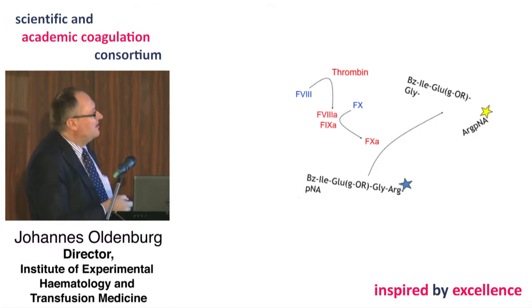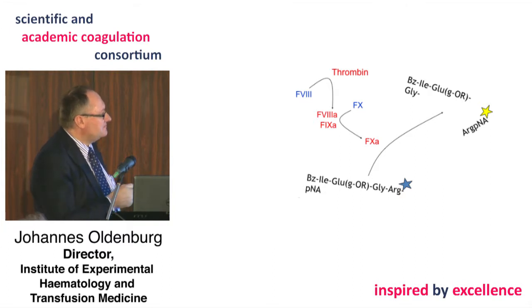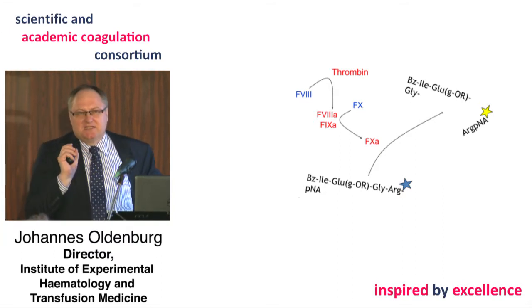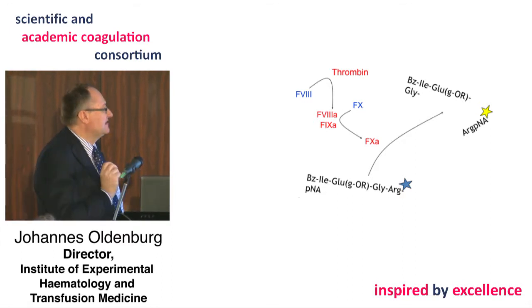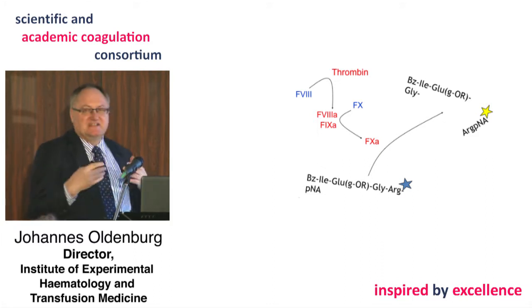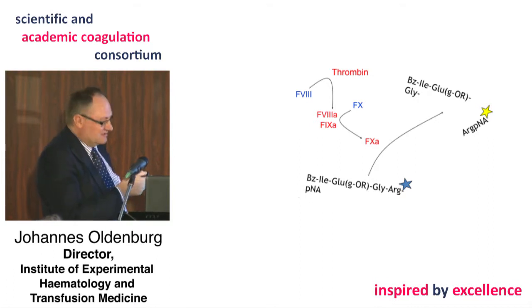So overall, we have a factor VIII concentration that correlates very linearly to the maximal extinction of the signal. So it's a very purified system with only a few reagents. These reagents are highly purified, and they are given in excess to this reaction.